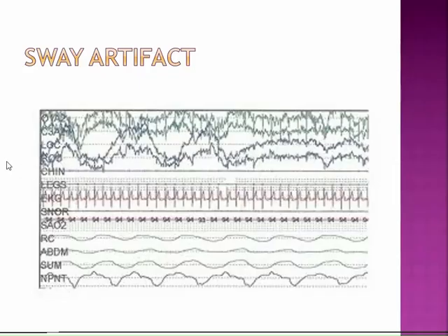It can make reading the brainwaves very difficult, because sometimes it can even cause the signal to flatline because it's just so bad. And you kind of have to read through the bounce to see what's happening.